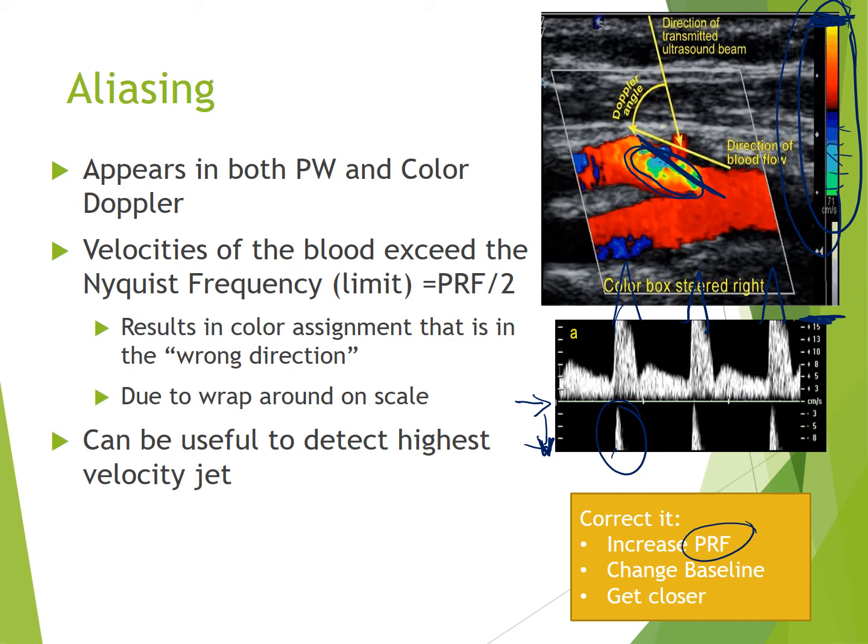The formula for the Nyquist limit is PRF divided by 2. You will also want to memorize that.